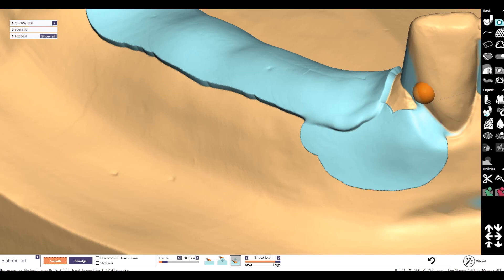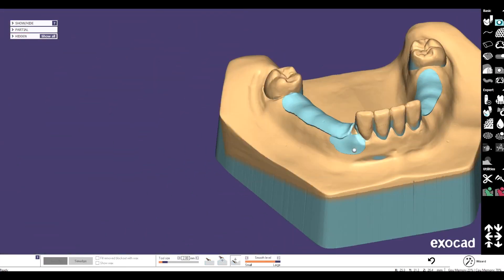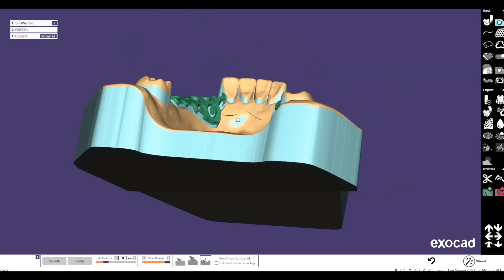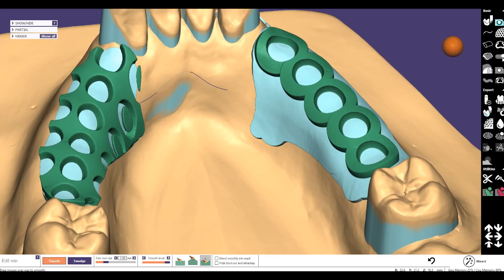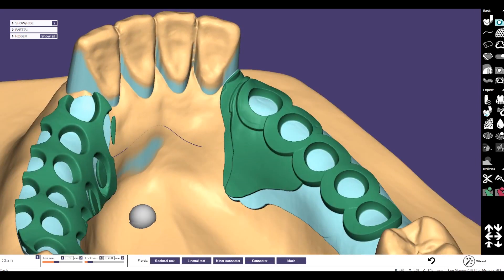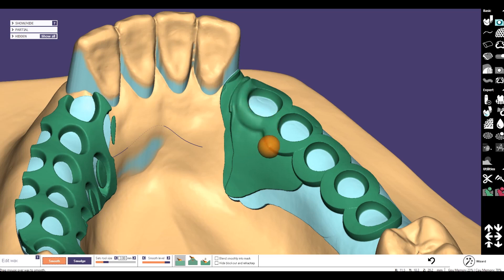We smooth the transitions here and also where the active clasp pool will be. Now we go to the add wax tool again. With the clone works tool you can very easily fulfill the rest of the work. The thickness can be zero point four. Also here the transition and the connecting for the sublingual area can be done with the clone tool, and with the smoothing tool you can make this a little bit smoother.